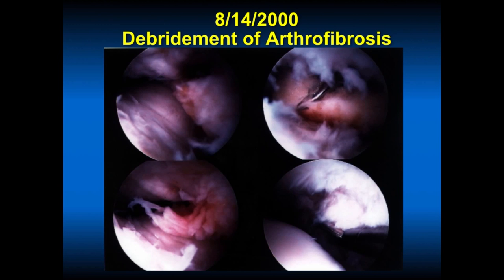In 2000, this shows debridement of a stiff knee with arthrofibrosis. You can see all the synovial tissue and scar tissue — scar comes from synovium, and the fat pad becomes very fibrotic. Aggressive removal of all this tissue and manipulation is done. Fortunately, we're not having to do as many of these because we've changed our prehab approach: working on range of motion, getting the knee more silent and normal before operating. More research is needed on the biochemical and genetic reasons for arthrofibrosis of any joint.